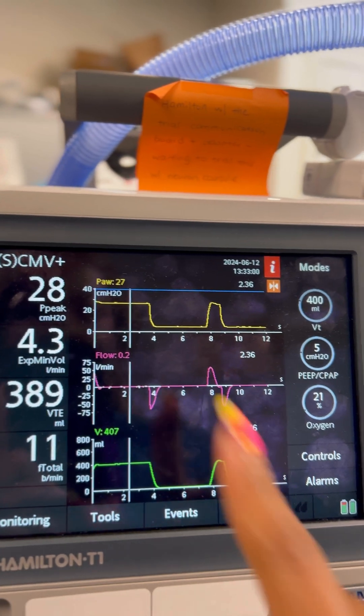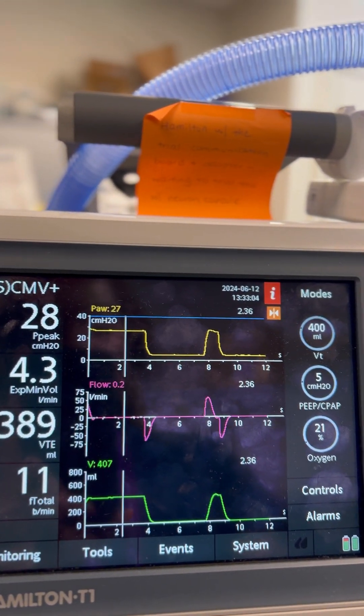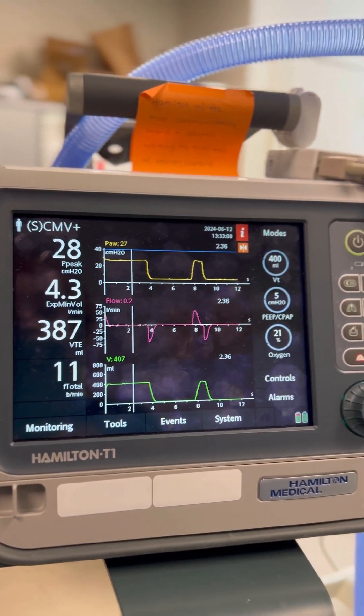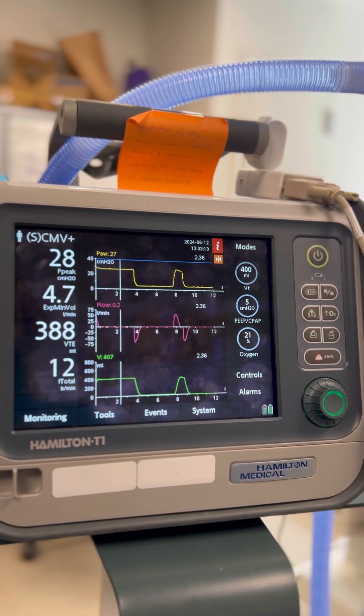There we see that the peak airway pressure, or the pressure at that point, is 27. That is our plateau pressure, and that's how you would perform the plateau pressure measurement for patients on the Hamilton T1. Thank you.